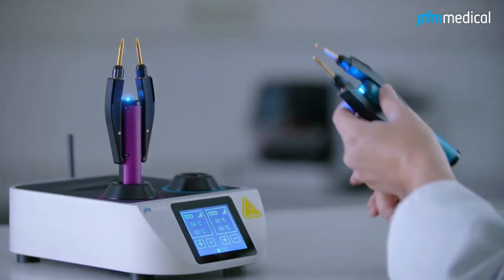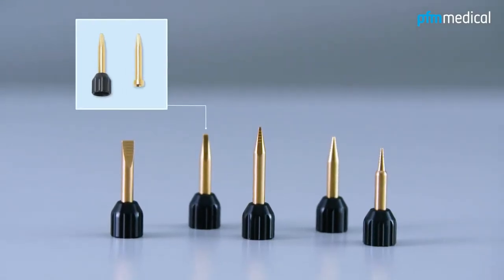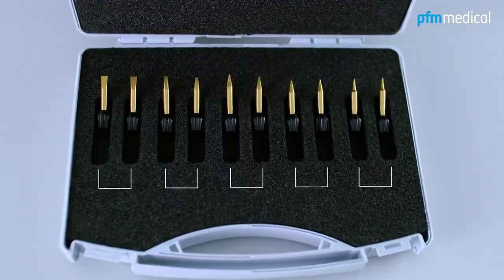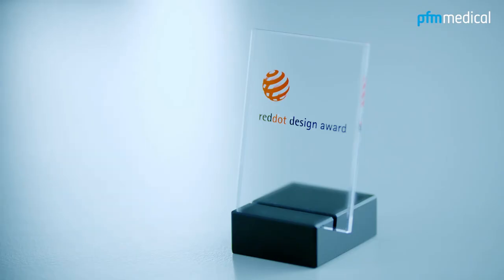The tips are gold-plated for optimal thermal conductivity. Five different types are available depending on customer requirements. The PFM Forceps EWF600 — simply outstanding.